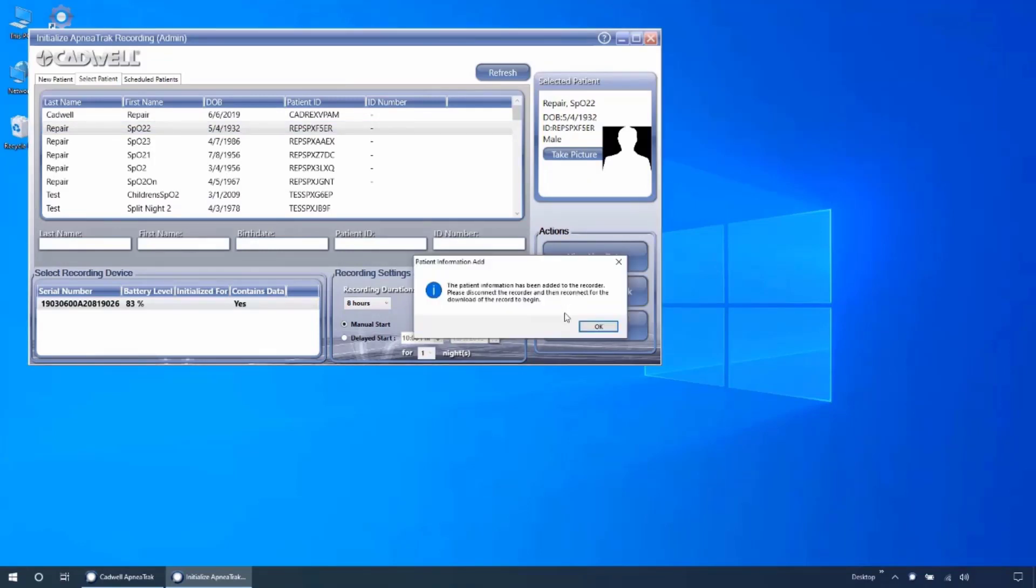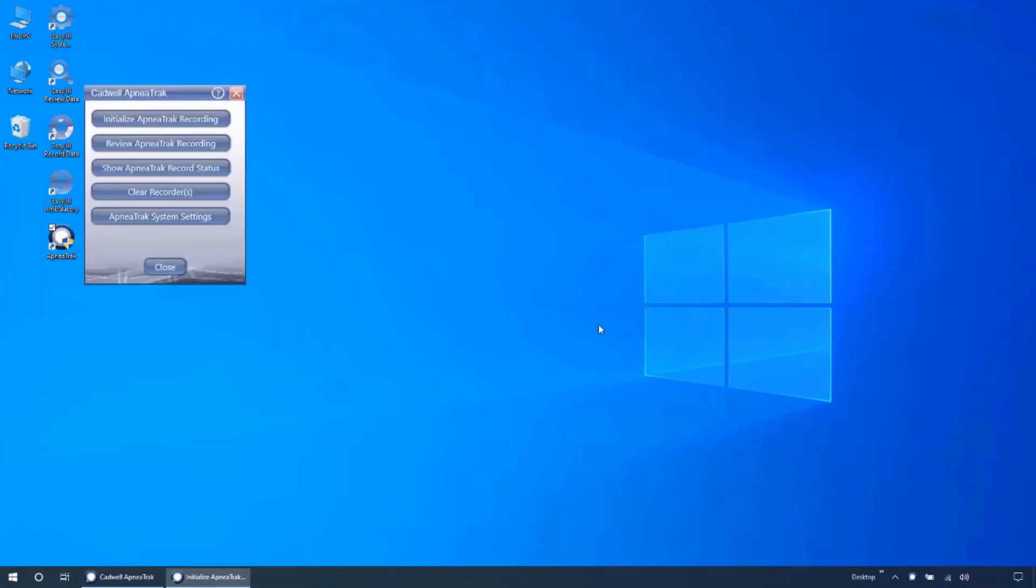You will then see a message to disconnect the device and reconnect it to download the data under the newly configured patient information.